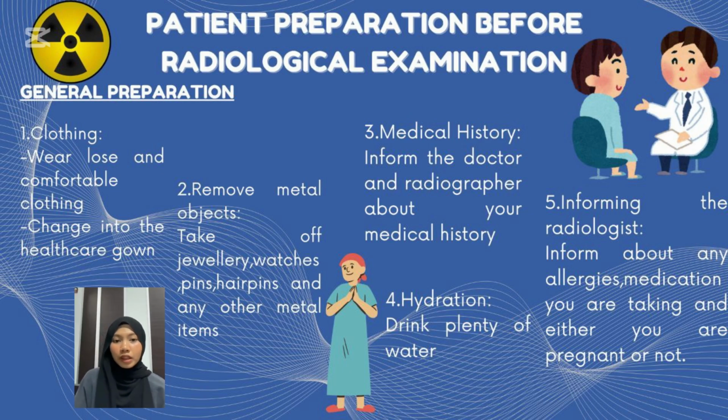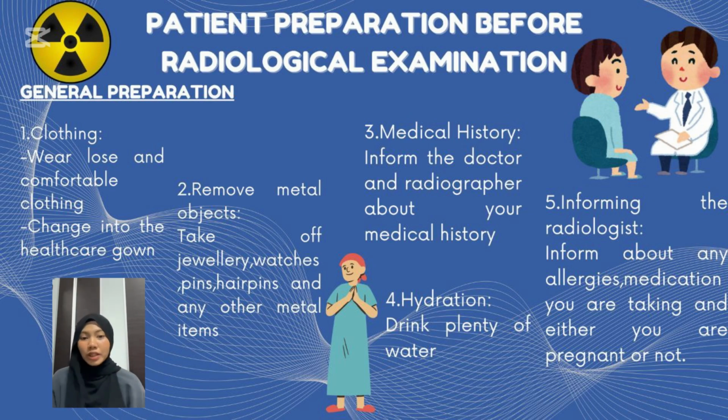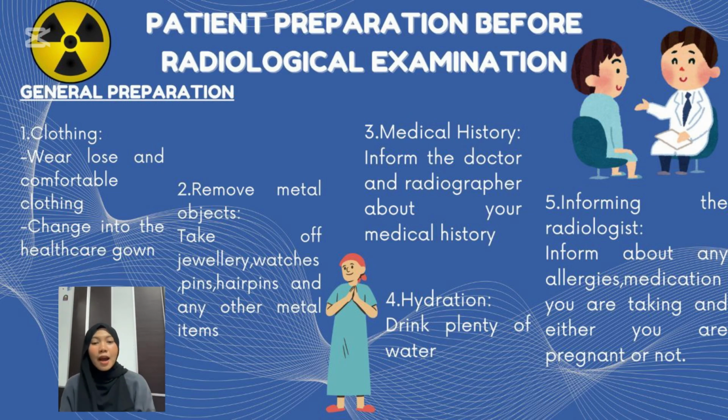Second, remove metal objects. Patients need to take off their jewelry, watches, pins, hairpins, and any other metal items that might interfere with the imaging process. Third is medical history. Patients need to inform the doctor and radiographer about their medical history, such as surgeries and any implants.